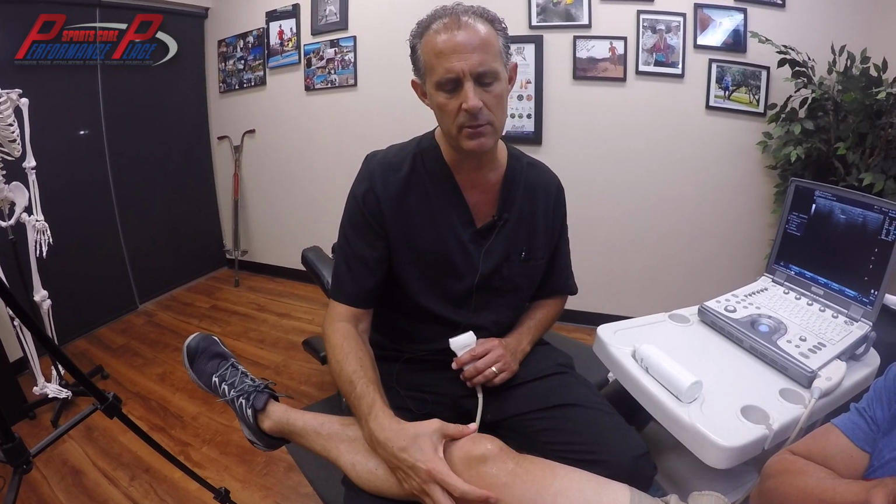So in this particular case with you, I don't see any need personally for an MRI at this point. There's nothing really to warrant that. I feel very comfortable with the effusion that's up here. If we were going to aspirate it, I would expect no less than 5 cc's and probably as much as 10 cc's of fluid to come out of here. And we would get it too. So I don't see any need for an MRI at this point, so we would put that on the back burner. But if this thing persisted and the pain wasn't going away and there was instability going on, we might want to look into it a little deeper and then bring an MRI in for that.